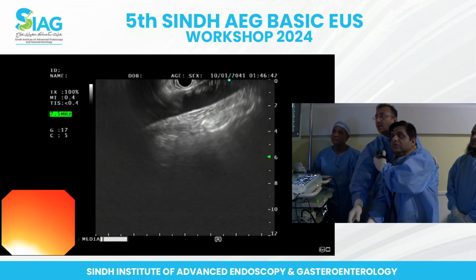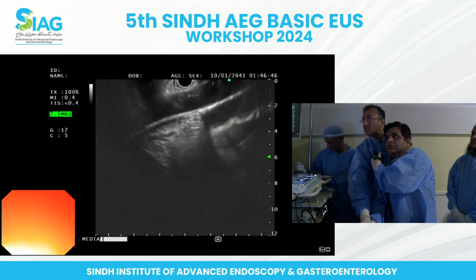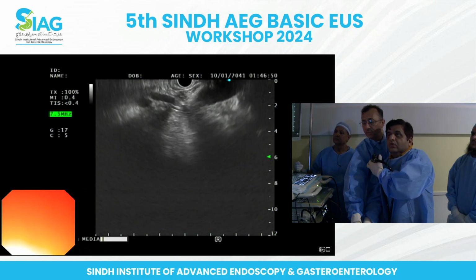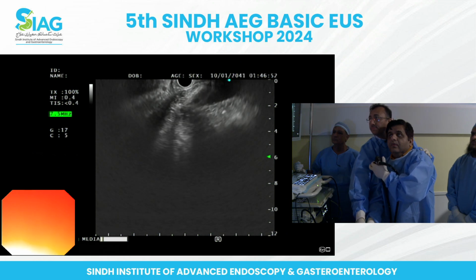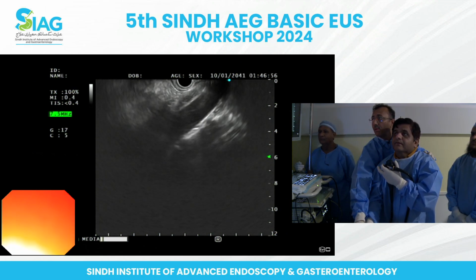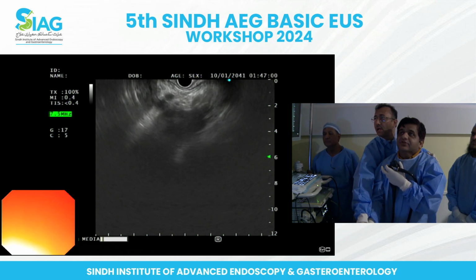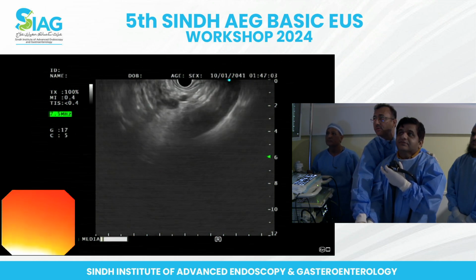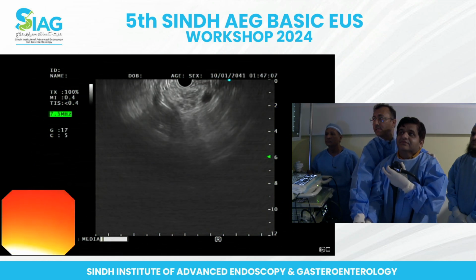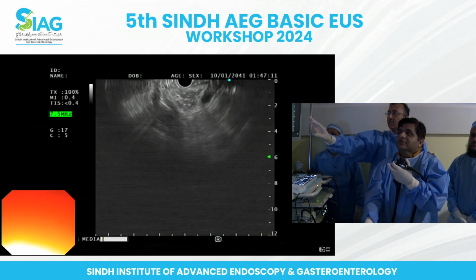There you have the aorta, right? Once you are there at the aorta, push the endoscope along the aorta. Now keep it along the... okay. Now you see the take of the celiac artery. Okay. Now follow the celiac artery, and there you land at the body of the pancreas. Now this pancreatic duct is right underneath your transducer.